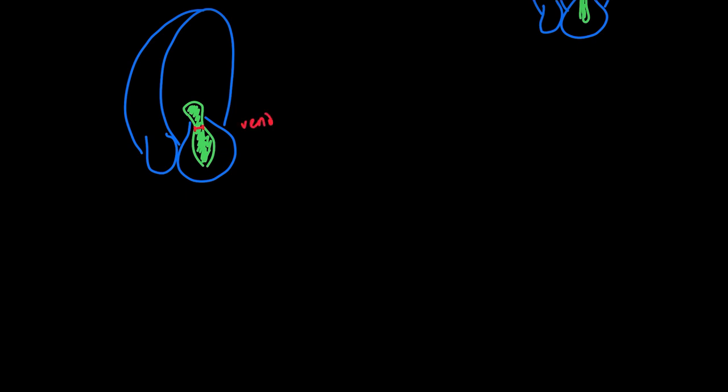Vena contracta. And that is a nice quick estimate. If we take our vena contracta and say that's the diameter, and then use pi r squared, that is a nice quick and easy way to estimate the effective regurgitant orifice area. It's a little bit of an underestimate.